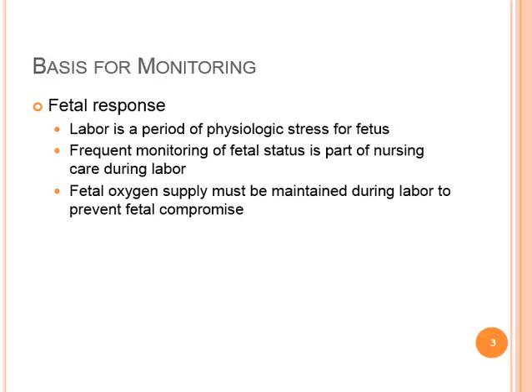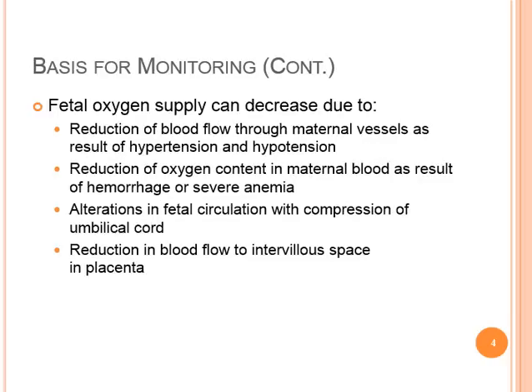Basis for monitoring: the fetal response. Because labor is a period of physiologic stress for the fetus, frequent monitoring of fetal status is part of the nursing care during labor. The fetal oxygen supply must be maintained during labor to prevent fetal compromise and promote newborn health after birth. The fetal oxygen supply can decrease in a number of ways.